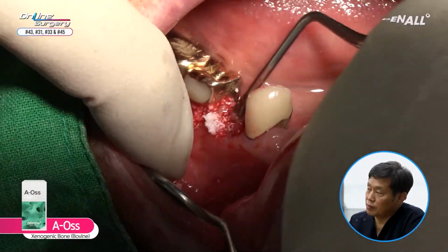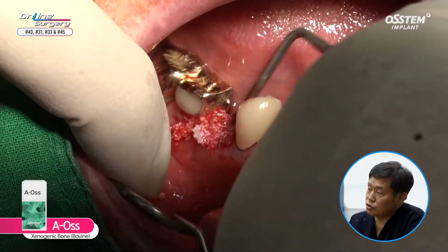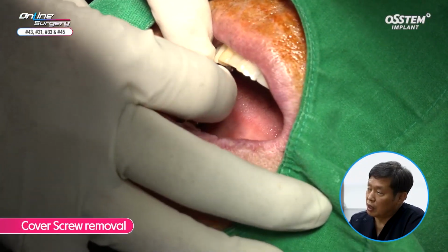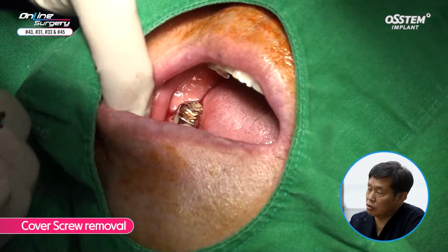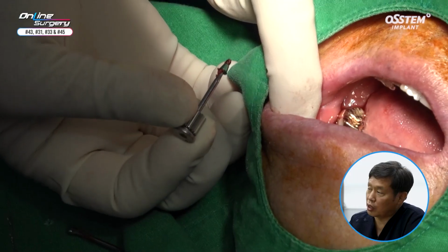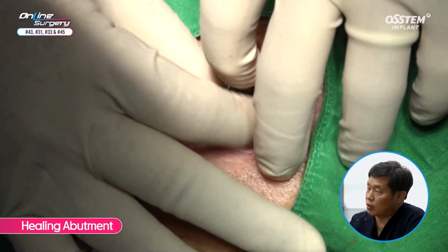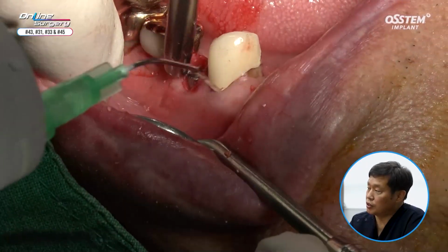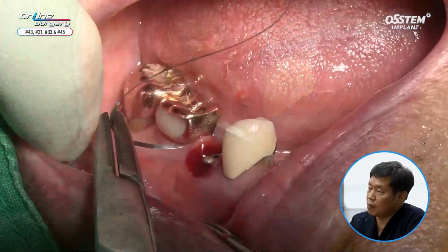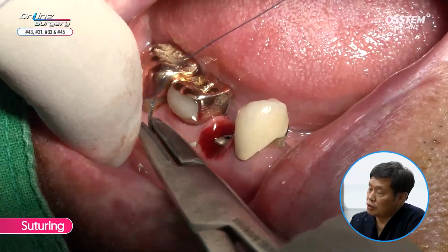And on the buccal side, sufficient bone graft was done in the buccal gap. If there's healing abutment because of contour, bone grafting can become difficult. Cover screw was removed, and in order to prevent graft material going in, healing abutment was connected. You can see that the extraction socket was full.